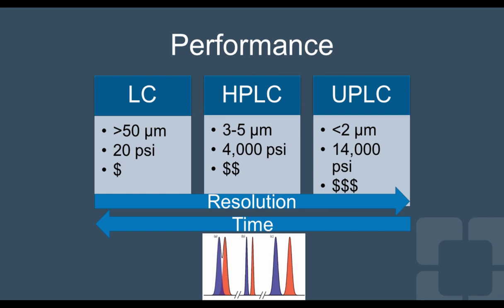So the ultra-performance liquid chromatograph can achieve a much higher resolution in a much shorter time. Thus, there is power in doing ultra-performance liquid chromatography, because we are demanding of doing many samples in a clinical laboratory, or have the demand of time upon us.